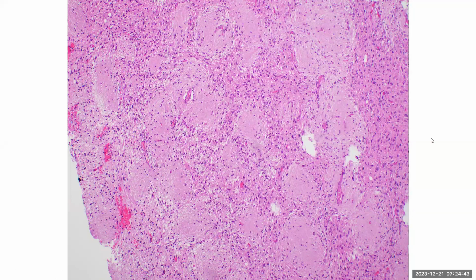It has a fibrillary background, almost neuropil-like areas, and small, not so atypical cells, more cellular to the right side here. I don't see any vascular proliferation or necrosis. Mitotic figures are difficult to discern at this power. So go to the next, please.